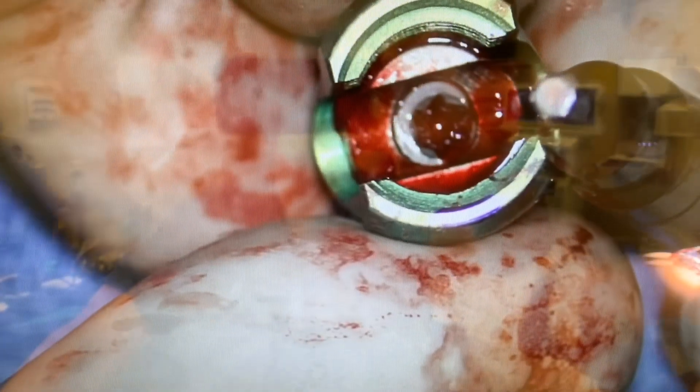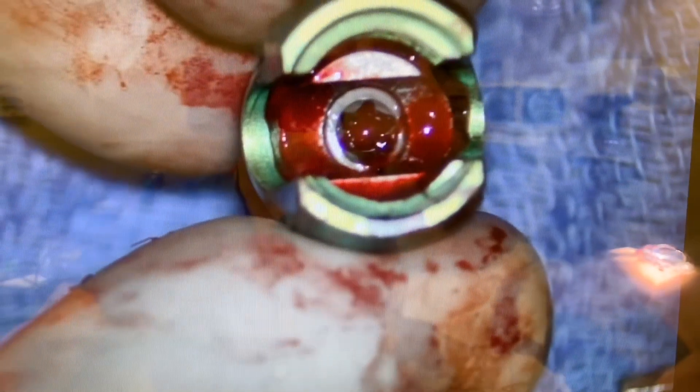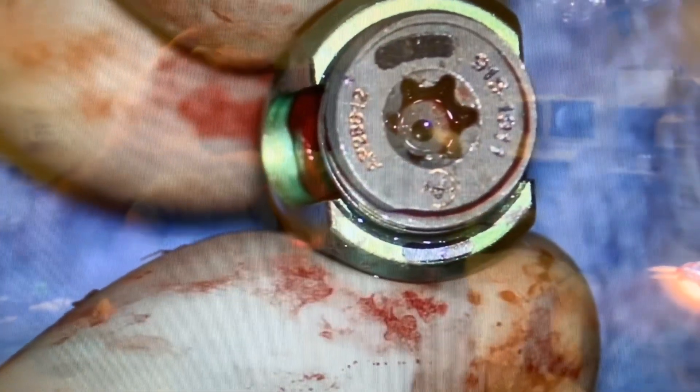The outer cap is easy. You should easily find a screwdriver that can fit it. You'll see it has the same shape — a 6-star, Star of David configuration — which is just bigger. That should be easy to find.